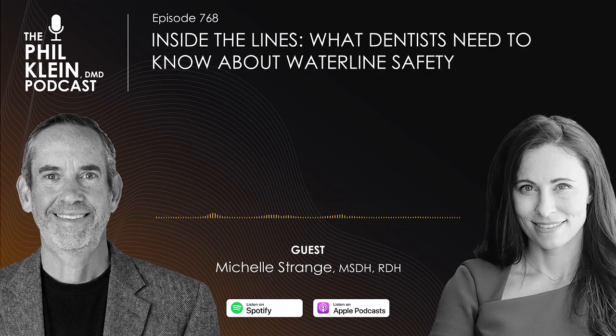overnight. I also like to remind people, please put some kind of sign, hang something, let the world know that you are shocking these lines, because they will need to be run with clear water.